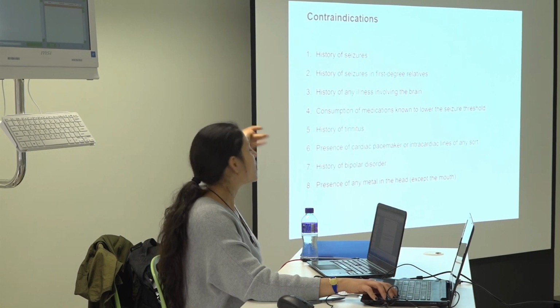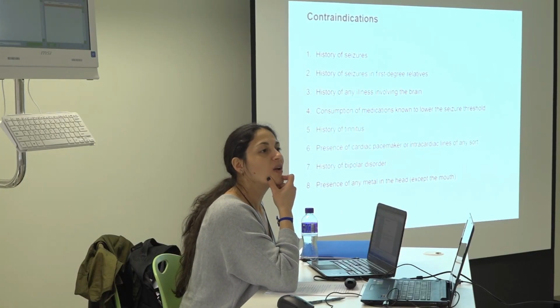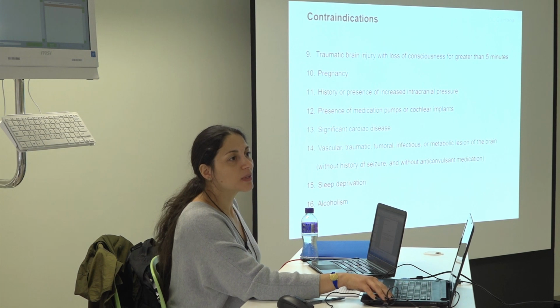History of bipolar disorder or any psychiatric disorder, you don't want to have. Metal in the head is a problem, but metal in the mouth is not. Nobody asked about it. You ask if you have metal in the head, and normally we say, oh, you have retainers, that's not a problem. Traumatic brain injury with loss of consciousness greater than 5 minutes, the story I told you about myself, is a contraindication, you don't do that. Pregnancy, no, because we don't know what can happen.